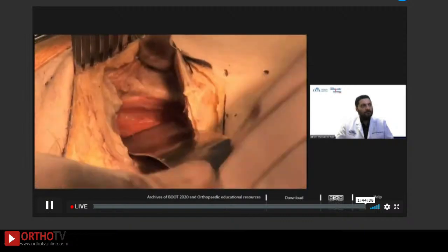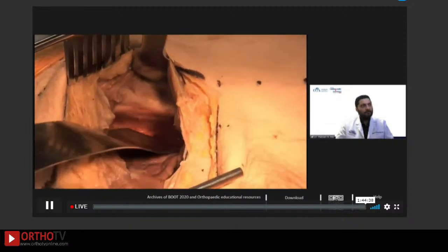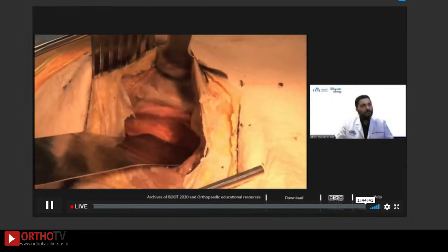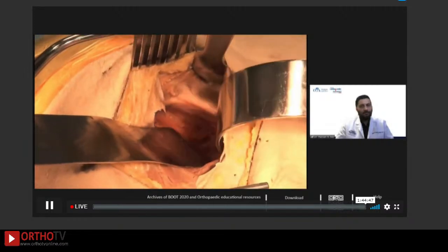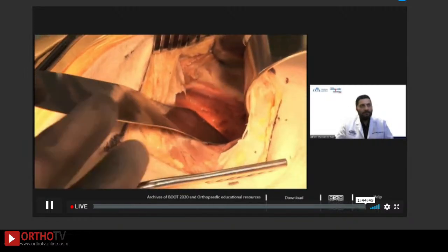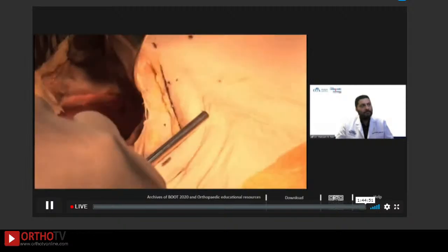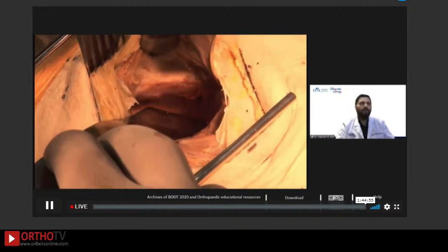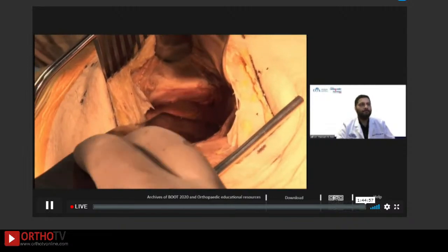We proceed cautiously after this point to avoid cutting or tearing of corona mortis vessels, as they may be under tension, especially with medially displaced fractures. A Schanz pin may be placed percutaneously into the proximal femur for an assistant to provide lateral traction. The Deaver and malleable retractors are repositioned to mobilize the window as we move laterally.